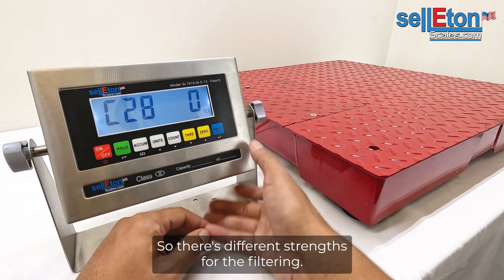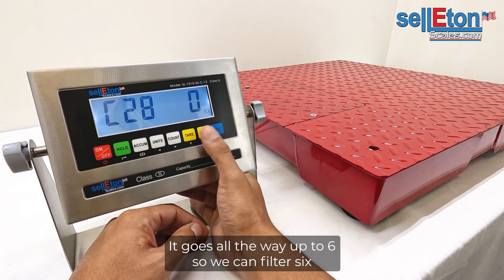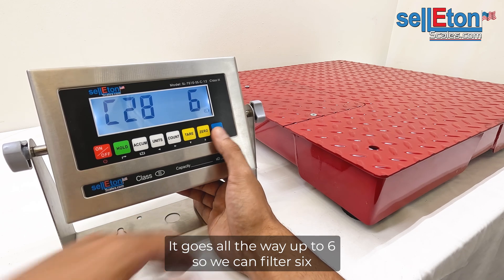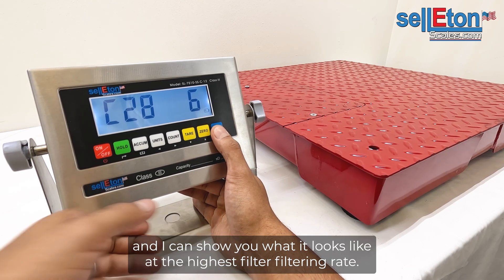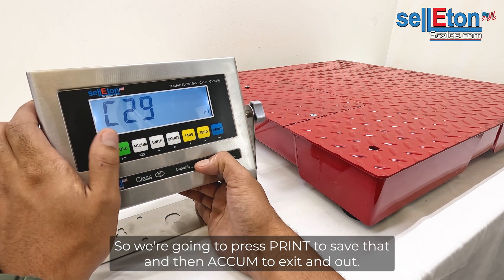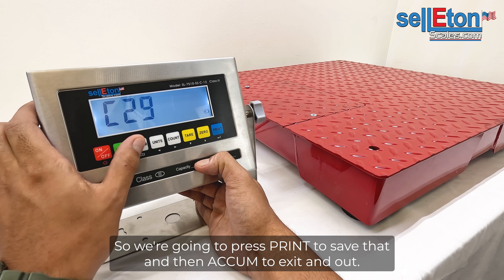There are different strengths for the filtering — it goes all the way up to six. We're going to put it to six so I can show you what it looks like at the highest filtering rate. We're going to press print to save that, then ACC to exit and out.